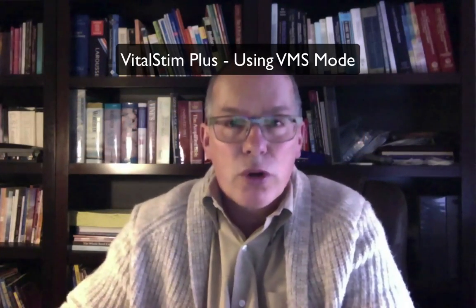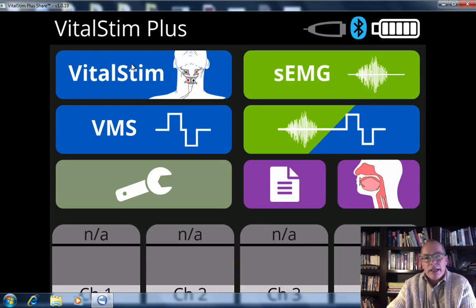Hello, I'm going to be recording another video, a very short tutorial, this one on how to use VMS. As you see on the screen here, the VitalStim Plus device has two different electrotherapy modes.